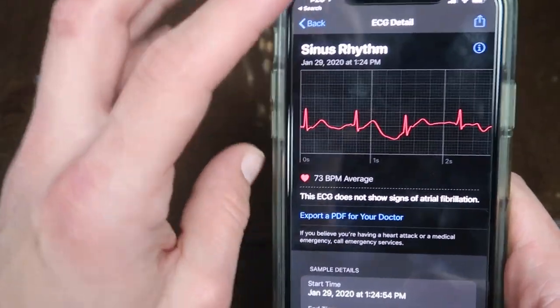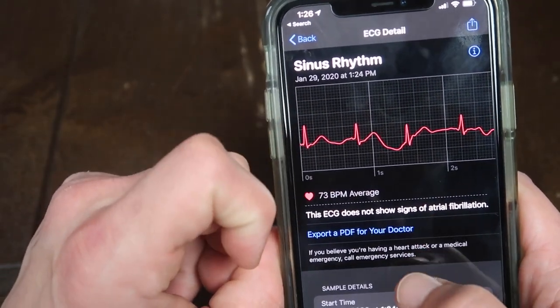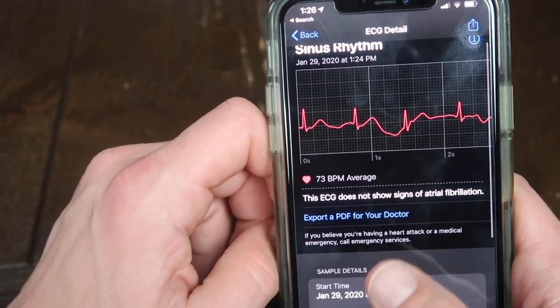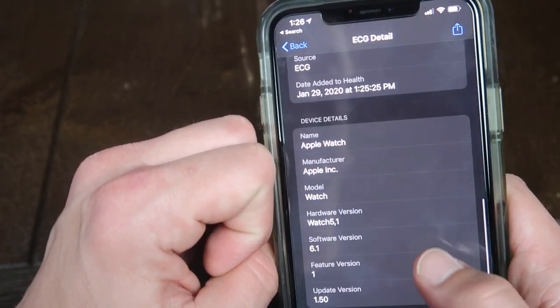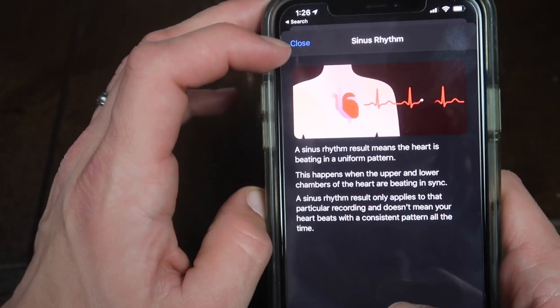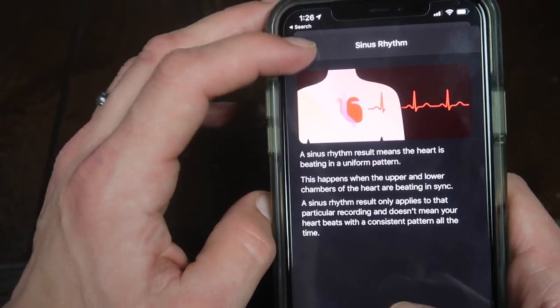So that was the ECG feature. When you're done with it, you can go into your Apple Watch app and look at the details. You can export a PDF to your doctor, which is kind of cool. It shows here I had a 73 beats per minute average. It gives you information about how you recorded it, and tells you what sinus rhythm is — it means your heart's beating in a uniform pattern. So that's good, I've got a healthy heart.